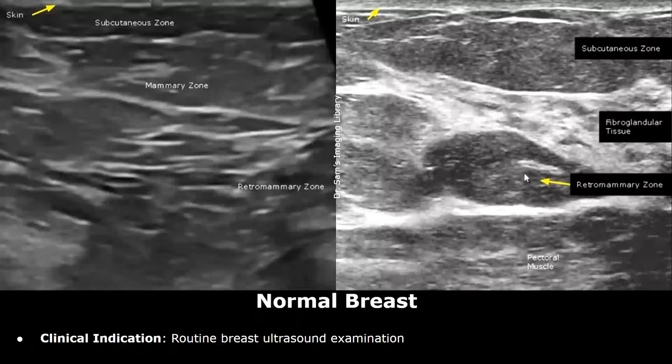Hello everyone, this is Dr. Sam and this video is about Breast Ultrasound Reporting. You will learn how to write breast ultrasound reports, including how to write the findings and the impression for different cases. Firstly, we will look at a normal breast ultrasound.